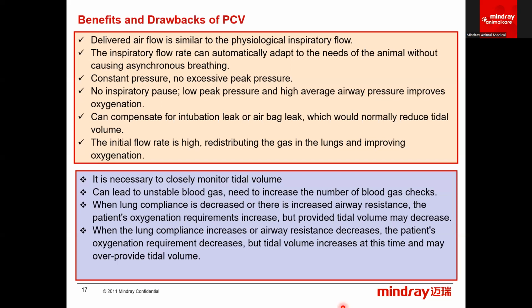You end up with a constant airway pressure, and so you don't run the risk of an excessive peak pressure like you might in volume control. There's no inspiratory pause, and the low peak pressure, those lead to a higher average airway pressure, which can help improve oxygenation.